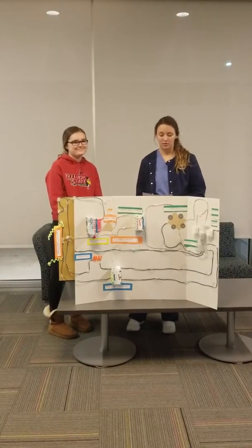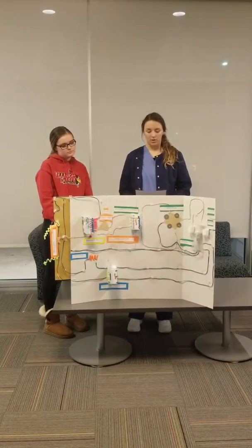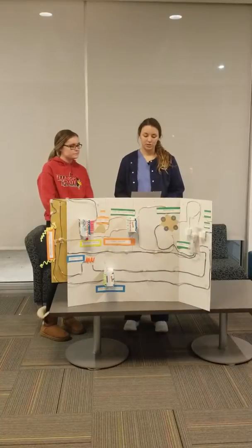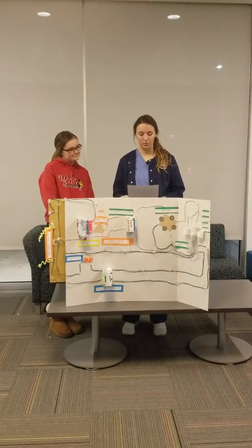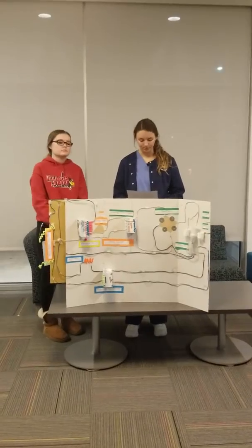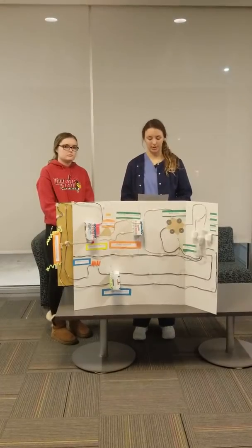The purpose of the anode is to provide a target for electron interaction and to produce X-rays, and it is an electrical and thermal conductor. The anode contains the anode target for the electrons and an induction motor with a rotor and stator. Materials used in the anode are molybdenum for the disc base, which has low thermal conductivity to minimize heat damage, and tungsten for the target material, which has a high melting point and high atomic number to improve efficiency. Rhenium is added to the tungsten to increase thermal capacity and tensile strength.